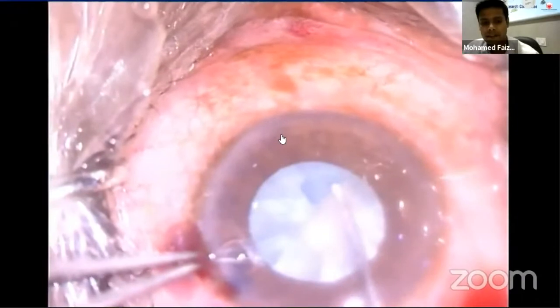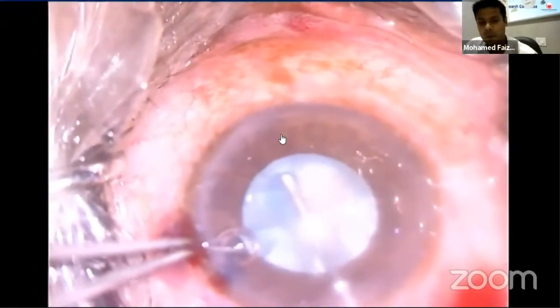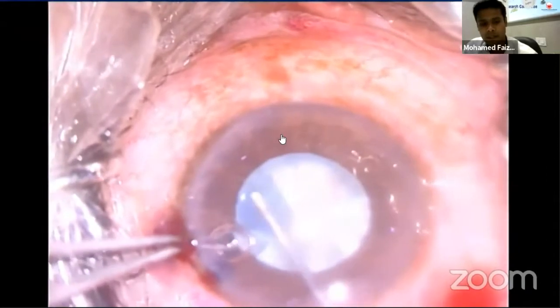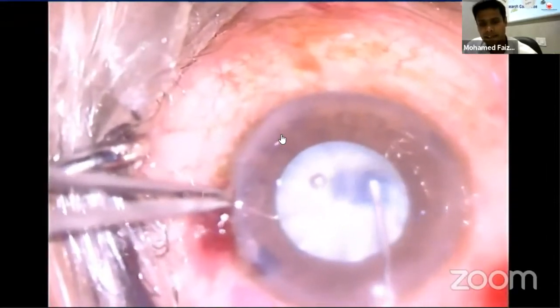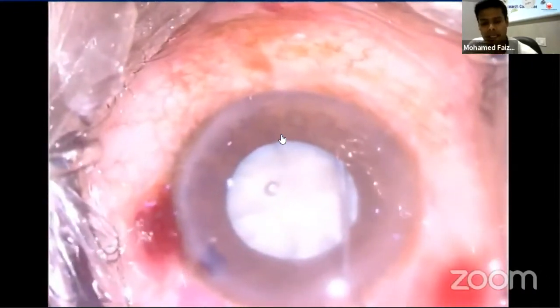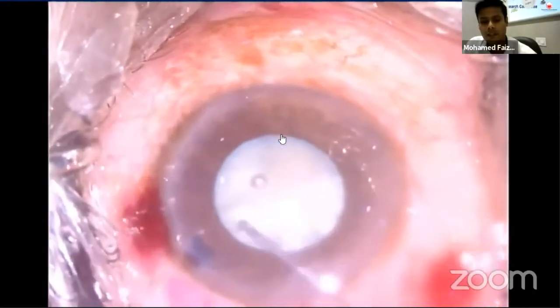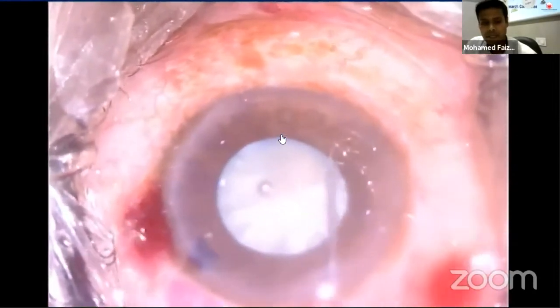The first step in successful divide and conquer lens removal is the creation of an adequate capsulorhexis. The rhexis should be no larger than 4.5 to 5.5 mm, as round as possible and centered on the visual axis. The next step is good hydro procedure, as divide and conquer technique requires rotation of the nucleus, so good hydro procedure is mandatory.